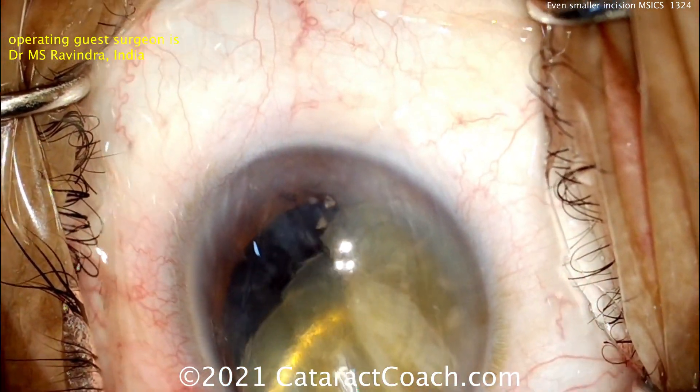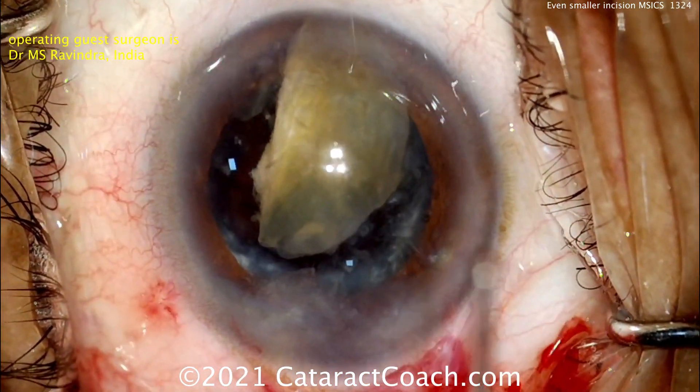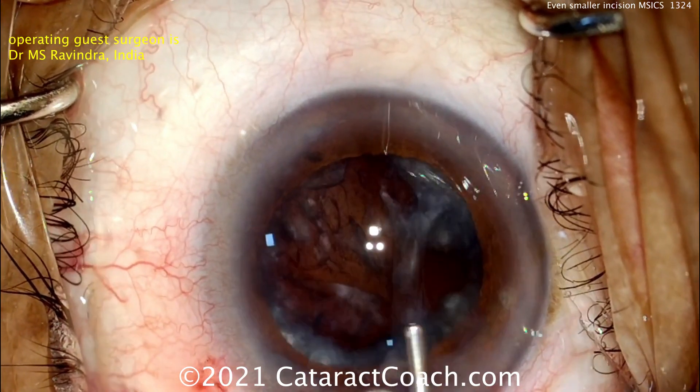Now using a little bit of traction, that first half can be brought outside the eye. And look — a smaller incision. He did it. More viscoelastic going in, probably HPMC. Again, using that lens loop on the bottom and then a cannula on top.